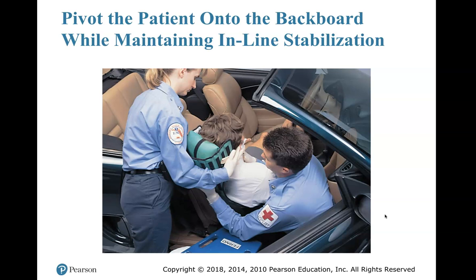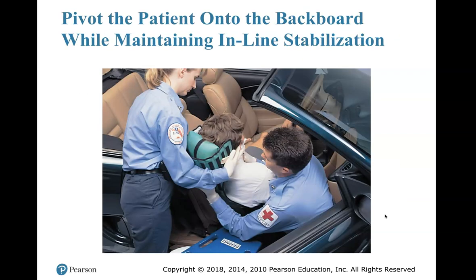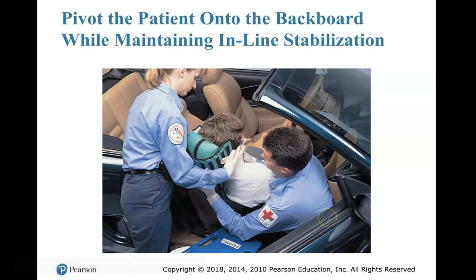And they rotate the patient and they're going to lay him on a long rigid backboard. If you can't tell, it's right here, the long rigid backboard. As you can see, they're working in tight spaces. If you're uncomfortable doing that, maybe the wrong profession for you.